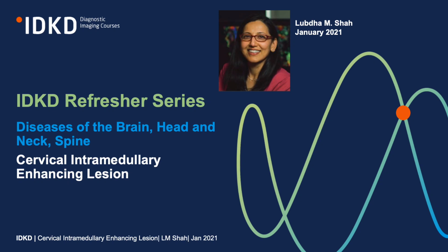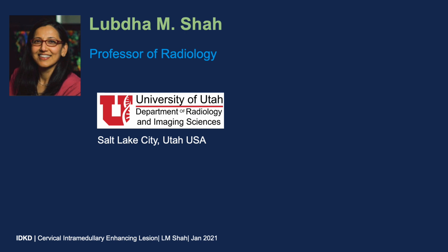Hello, this will be a neuroradiology case discussing the differential diagnosis of cervical intramedullary enhancing lesions.